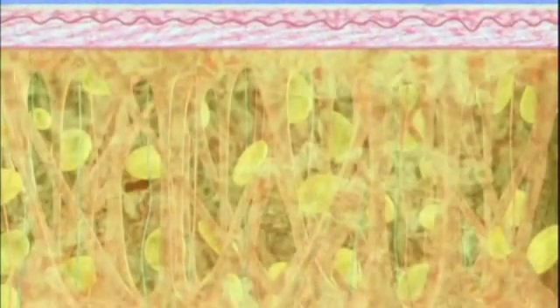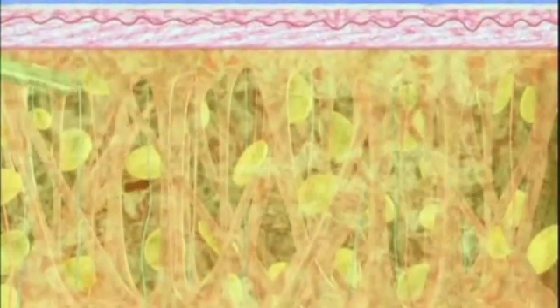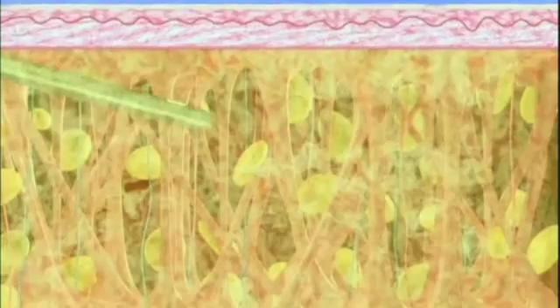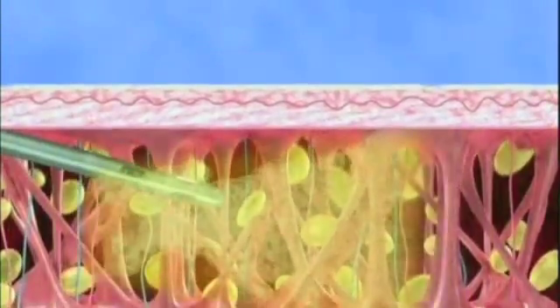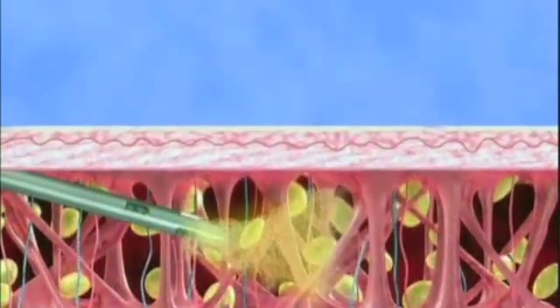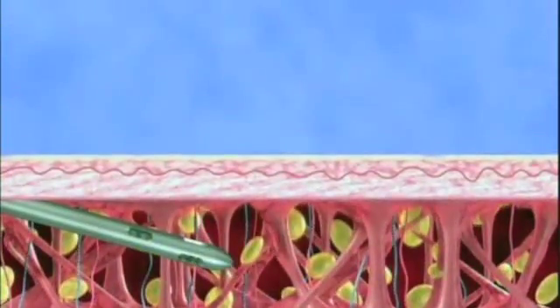Emulsified fat is removed with suction and massage of the treated site, again, without significantly damaging blood vessels, nerves, or connective tissues.